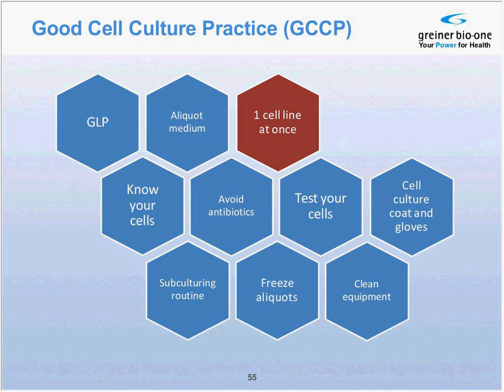And the problem of cell cross-contaminations, I would assume that this is one of the reasons how these occur, if people handle two cell lines at once in a cell culture cabinet. You should definitely know your cells or your cell lines, which means that you should check for their identity regularly to make sure that you wouldn't see any adverse effects, or that your assay really shows effects that depend on your cell line that you want to use.